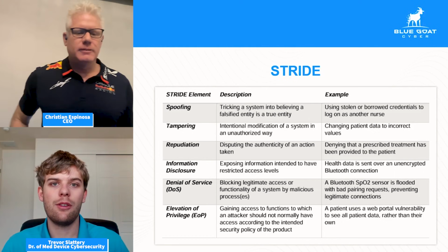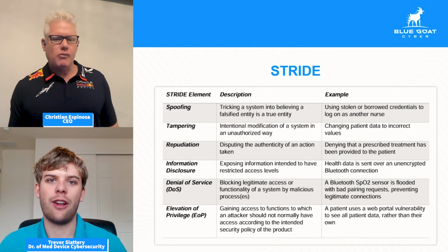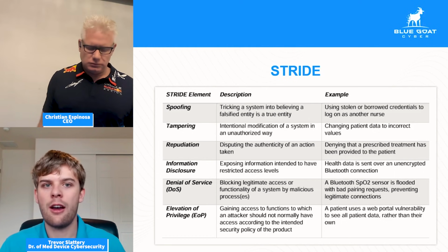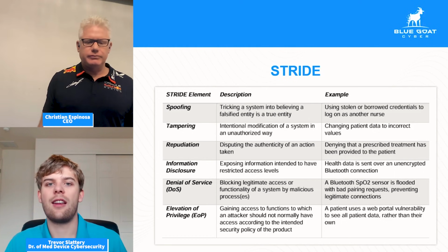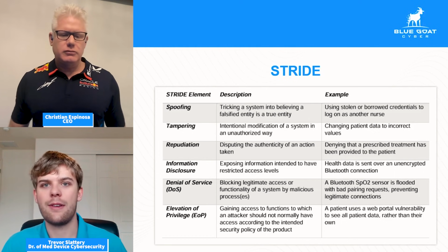And even that can be used for threat modeling mapping. It's not quite as comprehensive as a more fleshed-out framework such as STRIDE, but that is the traditional lens. That's cybersecurity 101. You look at confidentiality, integrity, availability. In this case, that's essentially the integrity of results, the integrity of information. You want to make sure that's accurate. You don't want to cause a misdiagnosis.